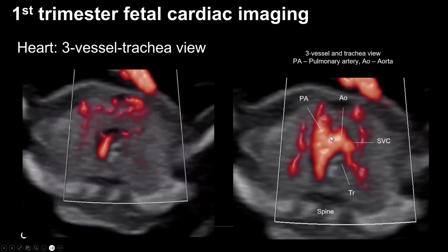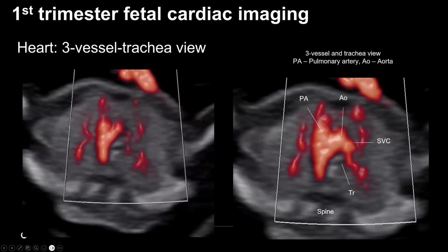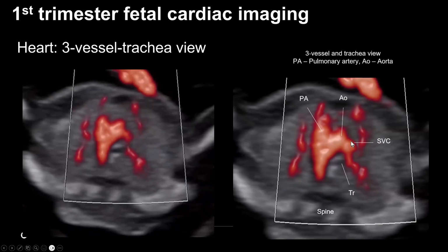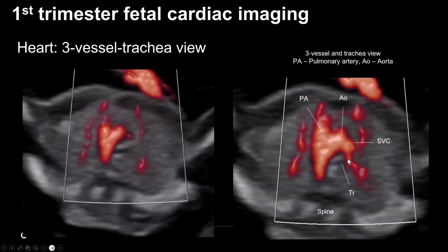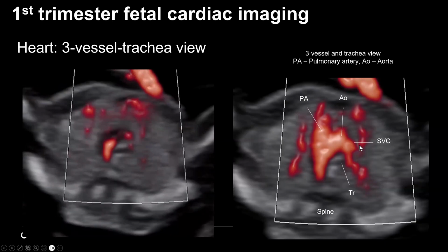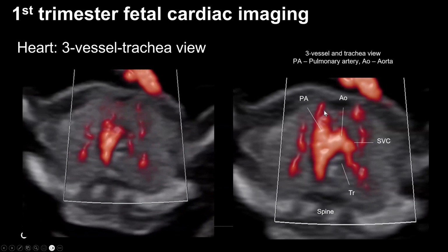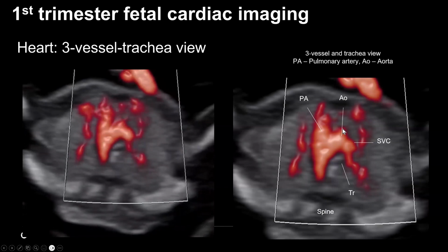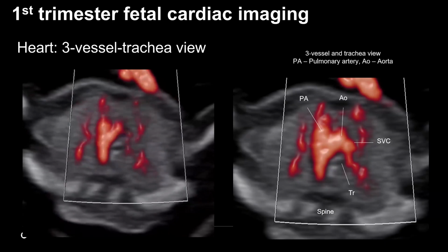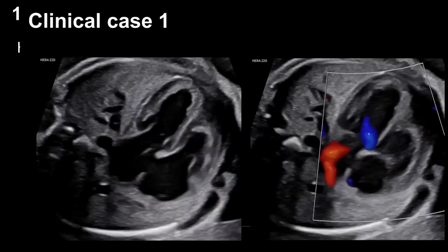And again, this is the MV flow, so you can see the resolution of this technique that helps to see the pulmonary artery, the aorta, the superior vena cava, the azygous vein that drains to the superior vena cava, and even the branches of the aorta, such as the internal thoracic arteries, which basically highlight the lateral borders of the developing thymus, so that the resolution and the details that we can see is really amazing.